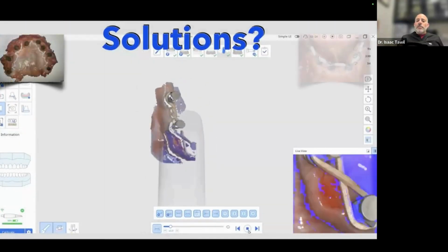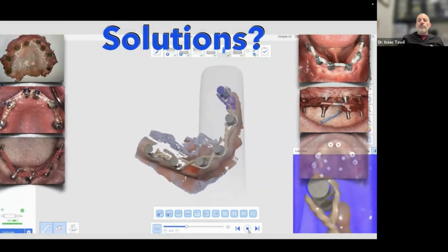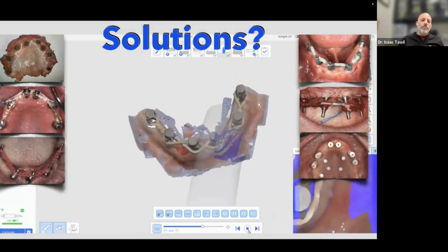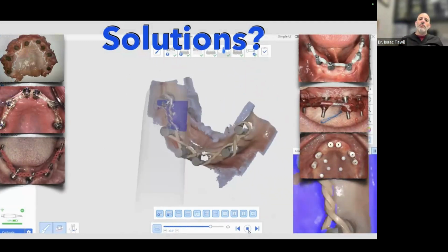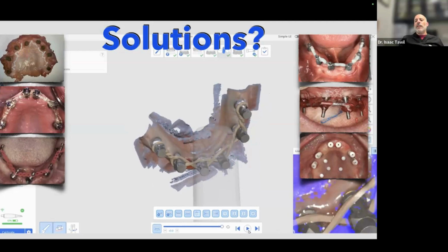So we've come up with lots of different designs and ways. I used to use rubber bands and things like that to try to carry me over. We've used tags, ortho wire, you name it. Up in the top left, there's my friend Jonathan Oppenheim, who used to do his composite curve to try to get some accuracy on that. It's very difficult. And we've come up with different types of scan bodies and things over the years.